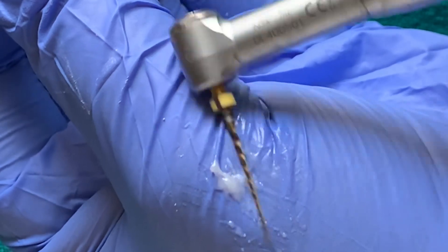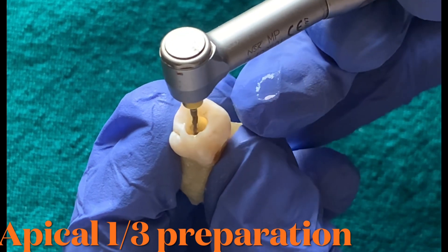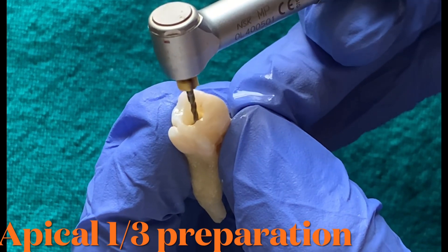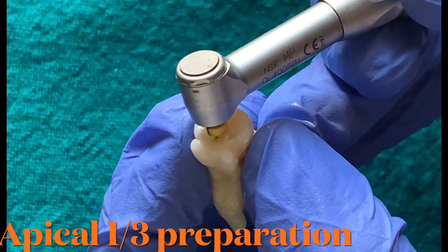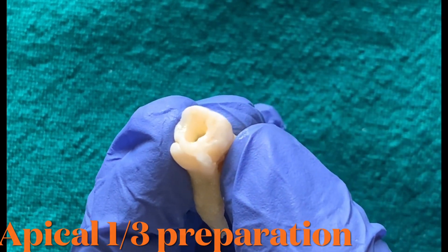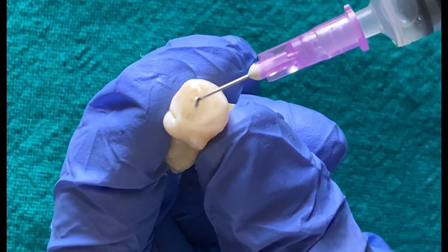After using the shaping files, we come to the finishing files, or F files. These files have been specifically designed to shape the apical one-third of the root canal, and they also progressively enlarge and shape the middle one-third. These files are allowed to passively float into the canal until they reach the working length, then they are pulled out, followed by irrigation and recapitulation.